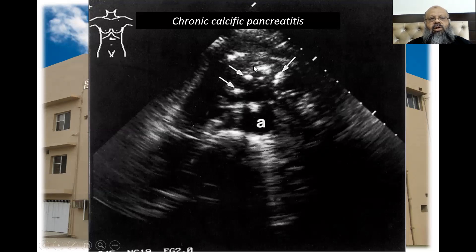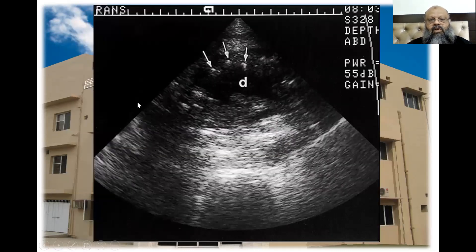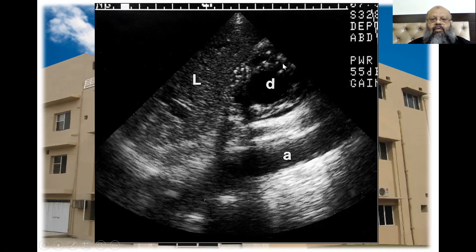Another case in which you can see multiple calcified areas with a hyperechoic pancreas and a chronic history of pain — so this is chronic calcific pancreatitis. This is another case of chronic pancreatitis with a pseudocyst, chronic inflammation, calcifications, and the duct is extensively dilated.